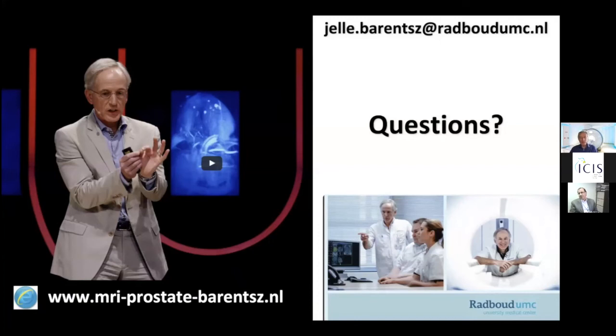That is a very good question, and of course, if you have an elevated PSA, only 25% of the patients have an aggressive tumor, so the rest do not. It's either an insignificant cancer, or it is a BPH, or it is prostatitis. And here you come to prostatitis. If you have difficulties in recognizing prostatitis on T2, which is sometimes really difficult, then contrast is really helpful.